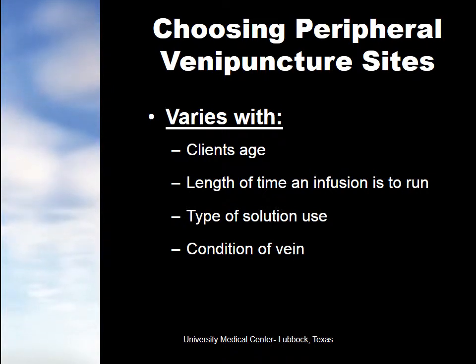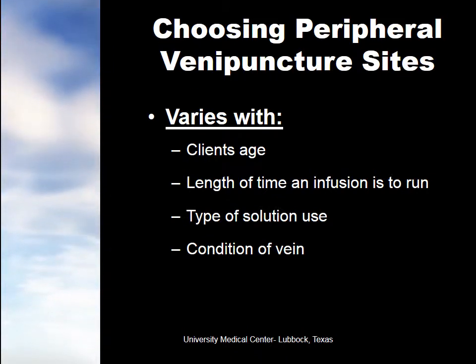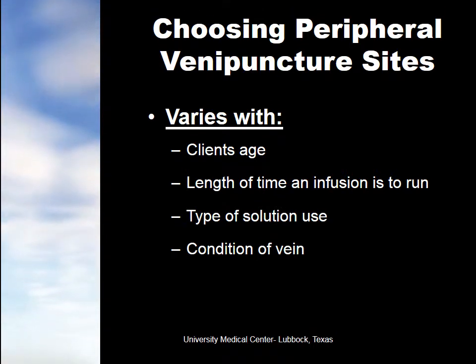Choosing peripheral venipuncture sites. This varies with the client's age, length of time an infusion is to run, type of solution used, and then condition of the vein.